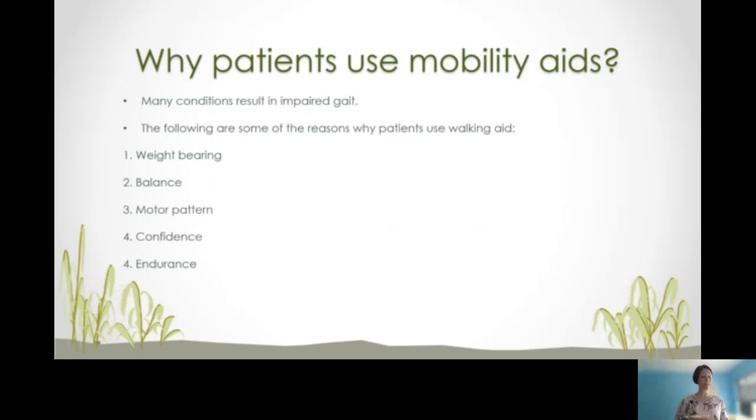Well, if you place a mobility aid in their hands, then they have an external aid to reduce the pain so that they can actually improve their motor pattern. So you may want to tell somebody, you know what, for a few days you will need crutches just so that we can improve your gait pattern while your ankle is recovering.